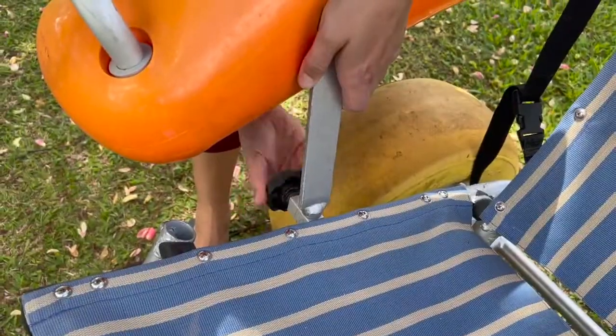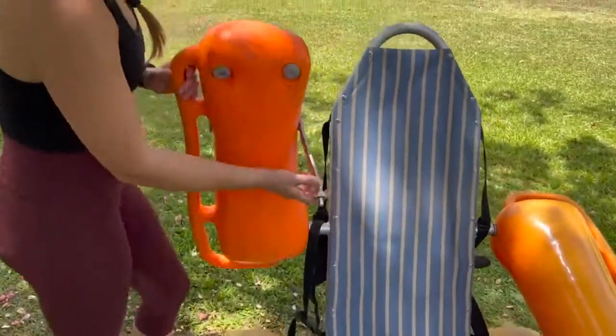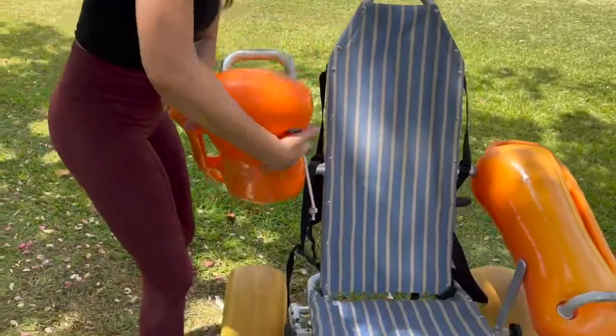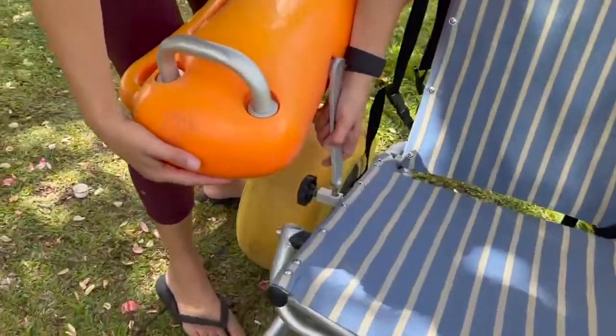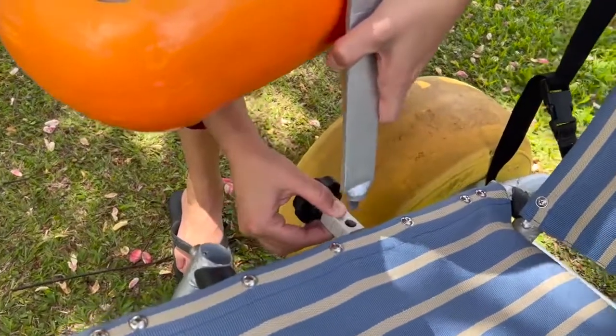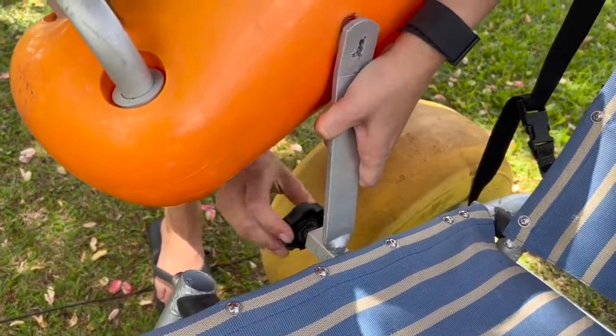To lift the armrest, loosen the quick release knob, pull the front rod of the armrest out of the opening, and rotate it towards the back of the chair. To resecure the armrest, rotate it forward and insert the front rod of the armrest into the opening and tighten the quick release knob. The rod with the opening rotates, so you may have to adjust the angle to accommodate the front rod of the armrest.